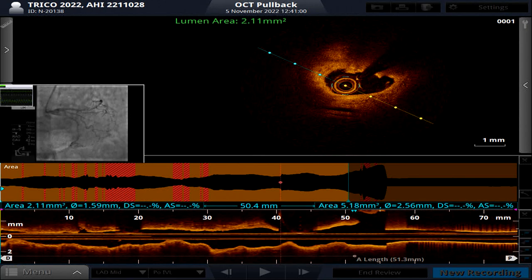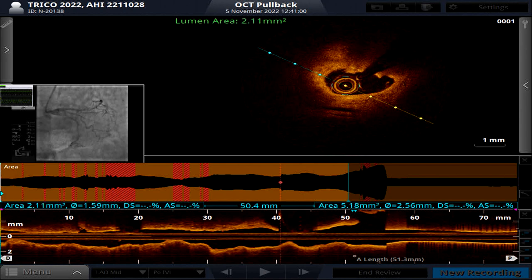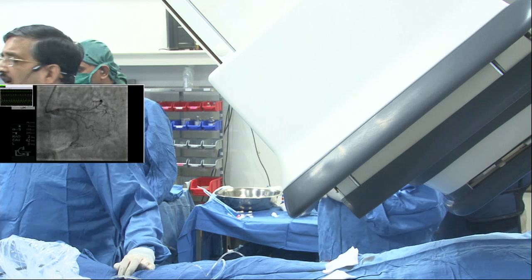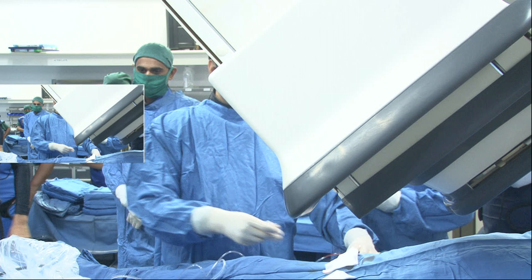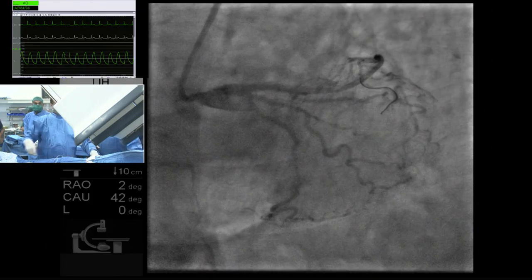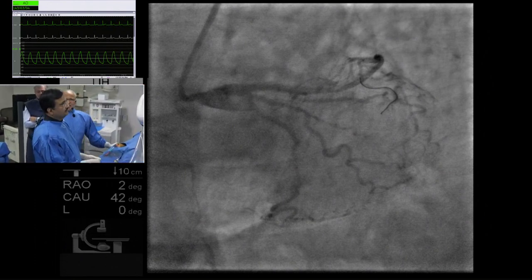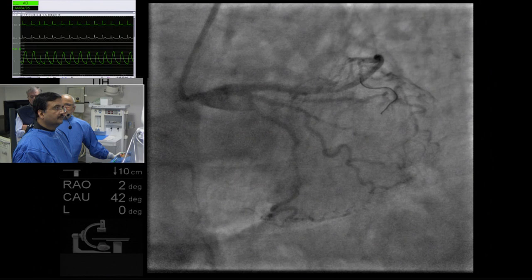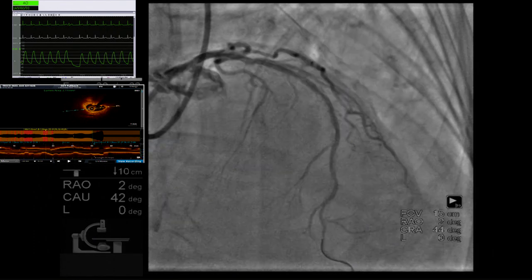So you're taking an Onyx. What's the diameter? So the Onyx comes in 26 and 30, or 34, but the 26 will be a better choice. And what diameter, 2.5? 2.5 will dissect distally, because the distal diameter looks to be around 2. I agree. Onyx expands much beyond your expectation, so I will be careful.